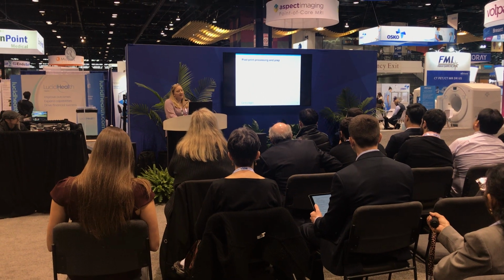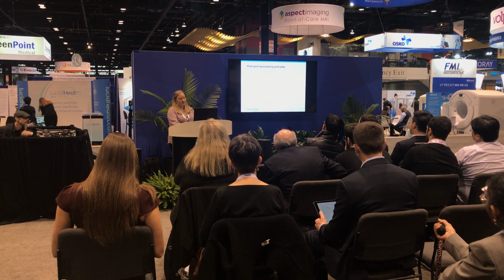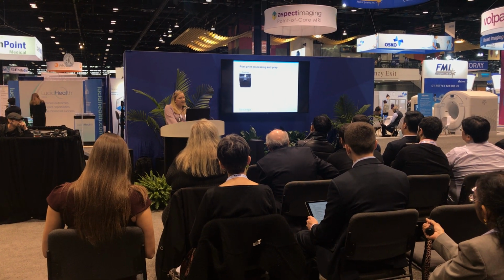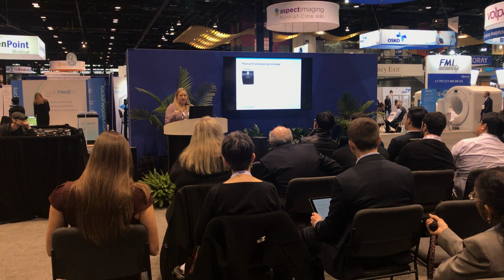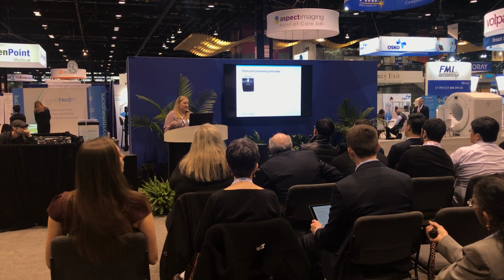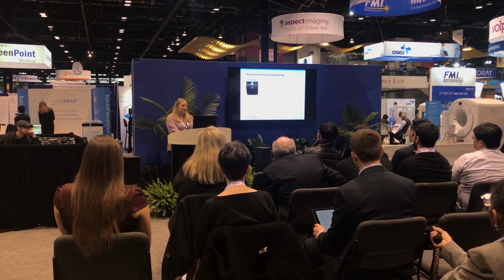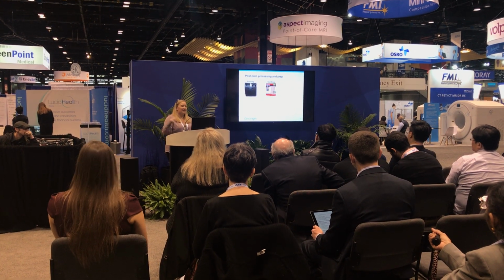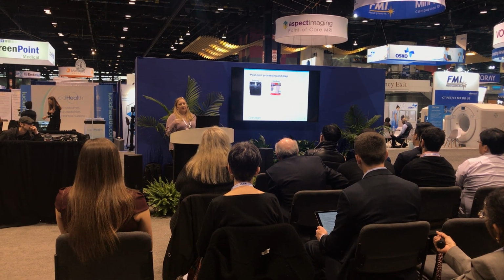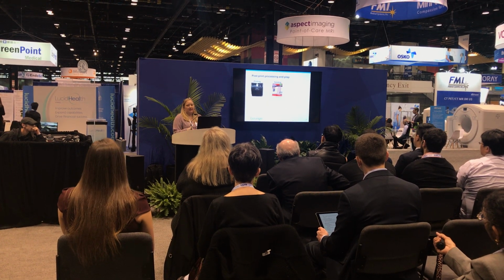So, post-print processing and prep: there is a little more prep involved for the mold. We like to use our binder jetting printer. The neat thing about the powder is it has a matte finish when you're done, so it's perfect for skin if you're going to be simulating any kind of skin. The big thing you have to remember though is the inside of that mold is going to be the outside finish of your model. So if you have layer lines, you want to sand those out, preferably before color bonding as well.